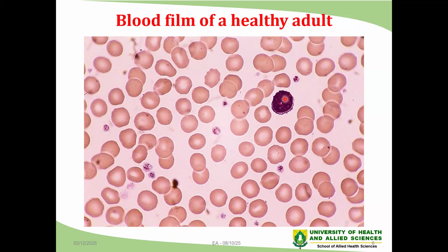The full blood count analyzer runs on principles, and sometimes whatever is happening in that individual may come with so many things that the analyzer itself gets a bit confused and it cannot tell what is what. However, with your training, you should be able to look at a blood film and say that, okay, it looks like this is what is really happening.